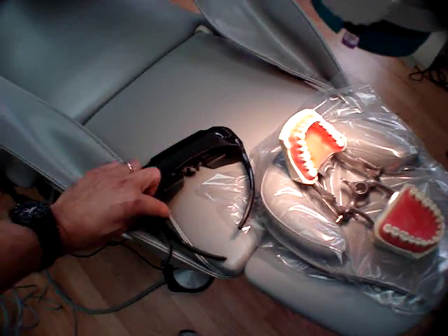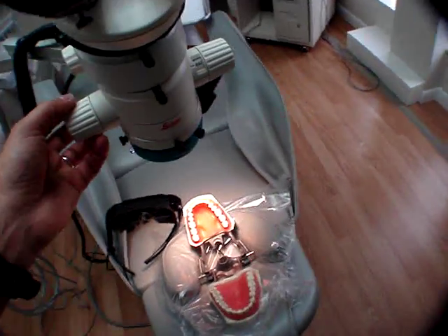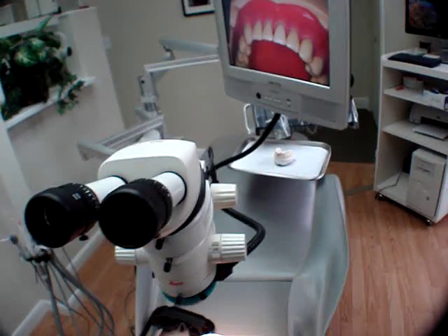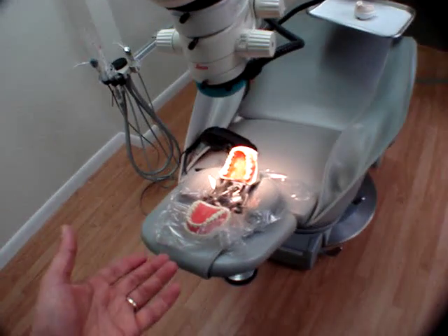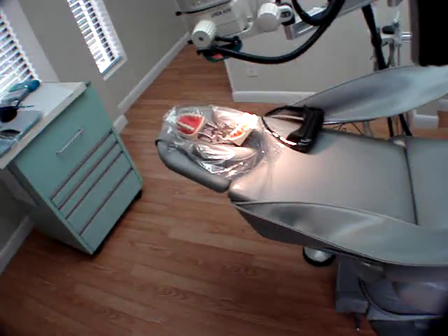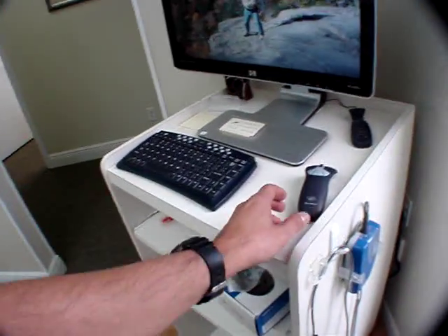So you have video eyewear, you've got the microscope tied in with that, you've got the dental assistant on board, and now all you have to do is record. Let me show you how we do that. This is just your typical typodont that we used in dental school. I've got the video camera running already inside the microscope.